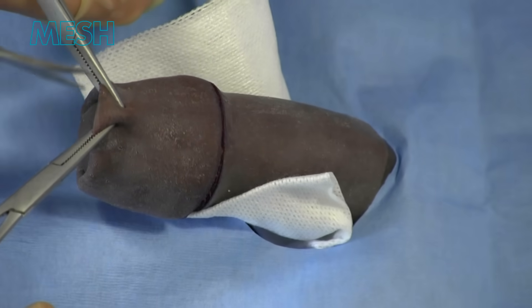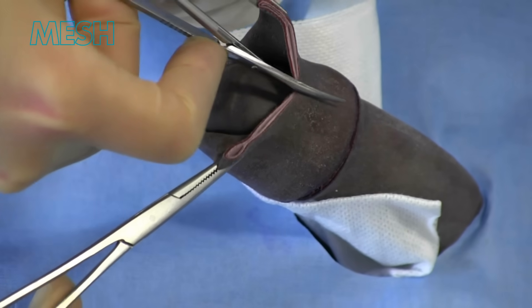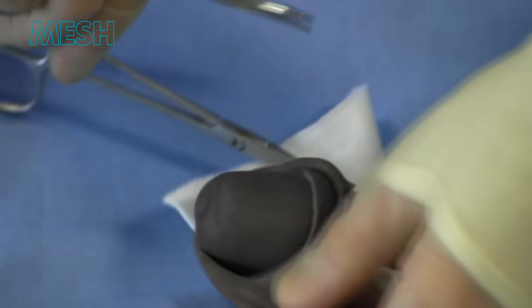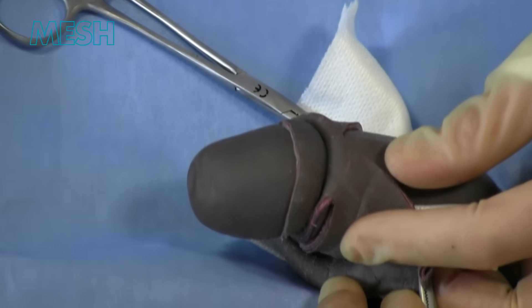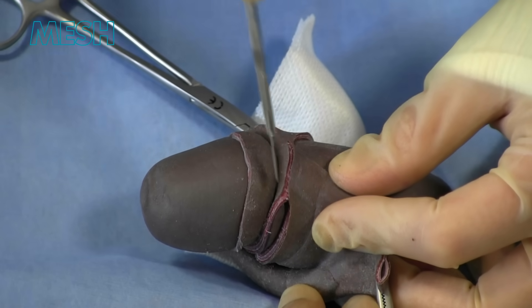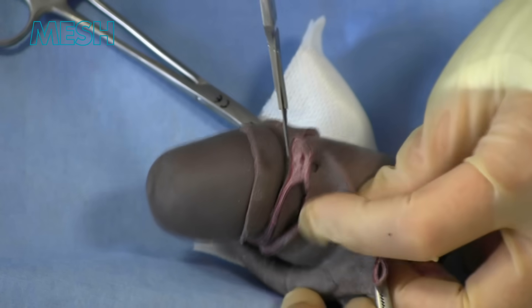The outer incision is completed, followed by an incision through the foreskin between your two clips. Once the foreskin is retracted, a betadine swab can be used to clean inside. The inner incision is now performed around 3mm from the glans. This will become your tissue that you suture to your outer incision.